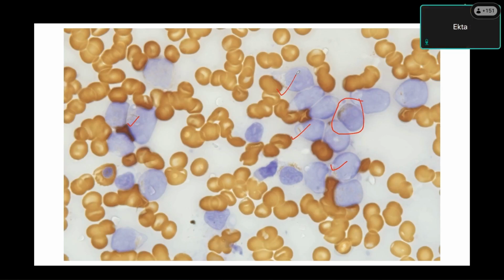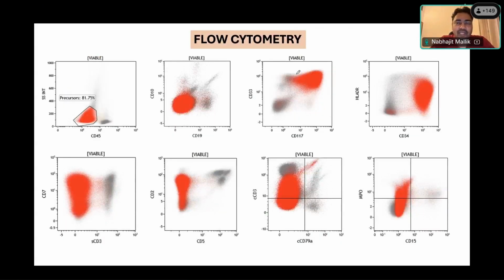Go for flow cytometry. Wonderful. So let's go for flow cytometry, and that has now become a technique of choice for diagnosing acute leukemias. Definitely, we have to do an MPO initially, but also we have to do a flow cytometry to make a final diagnosis of an acute leukemia these days, right? So this is the flow cytometry plot that I give. Before we go here, Jasleen, Big Rai, and Ekta, do you have flow in any of your centers? No, sir. Not really, right?